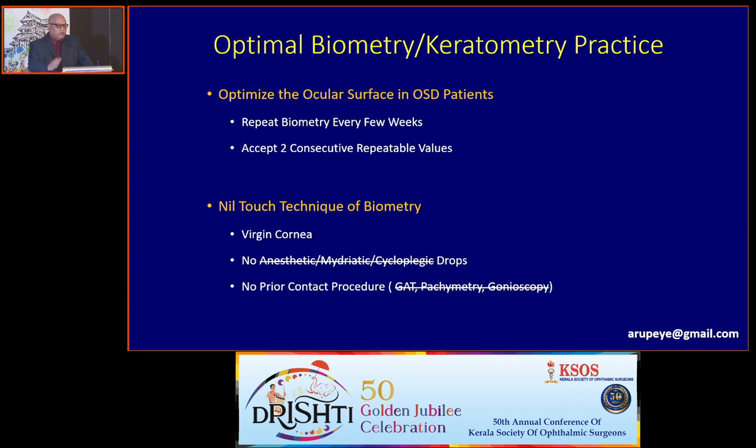I would like to emphasize the nil touch technique of biometry. When you do the biometry, the cornea should be pristine, it should be virgin. It should not be done when we have put dilating drops or anesthetic drops on the patient's eye, or when Goldmann applanation tonometry or gonioscopy has been done.